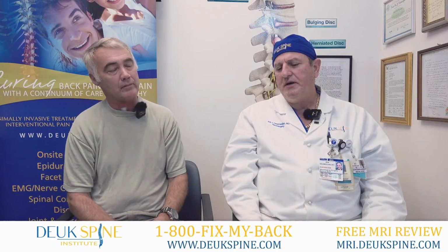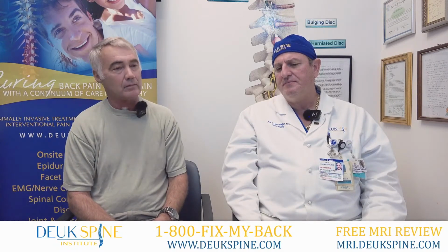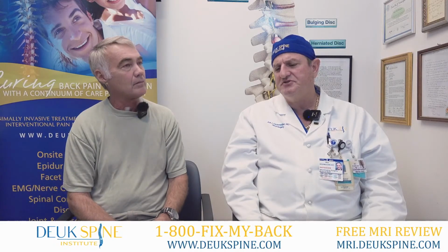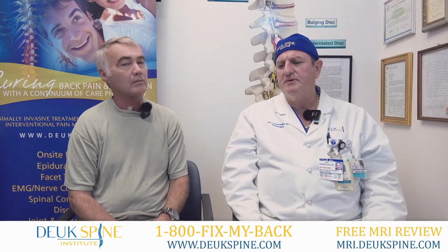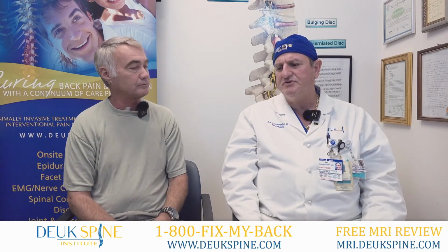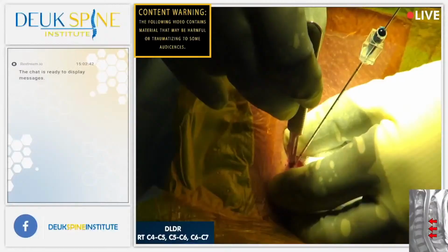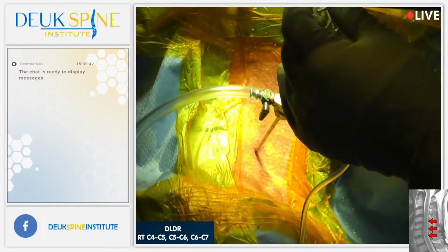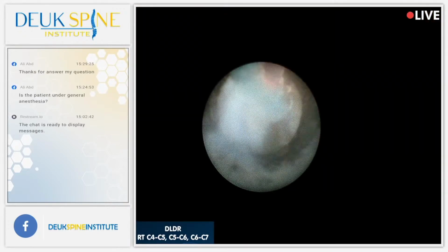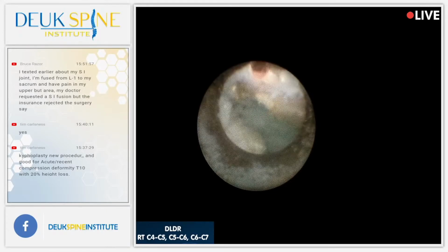But you broke it up into 2 procedures, and we get people all the time asking us, oh, can I come there and get my neck and my back fixed? Yes, you can. We'll probably do it on separate days. So you got 3 discs repaired yesterday. You can actually see right here in this video footage how small the incision is, tiny. And I was in there endoscopically using a laser to clean out the tear and remove the small herniations.